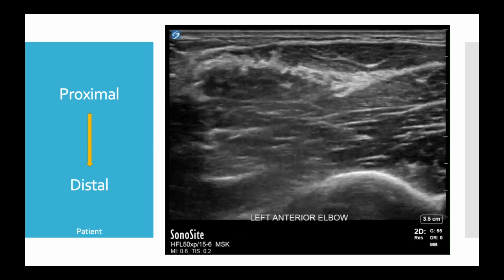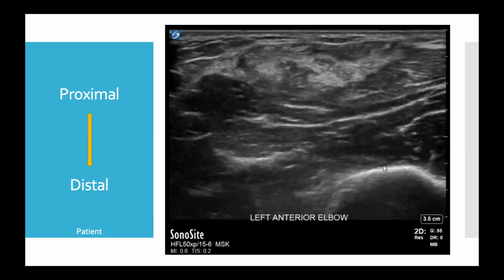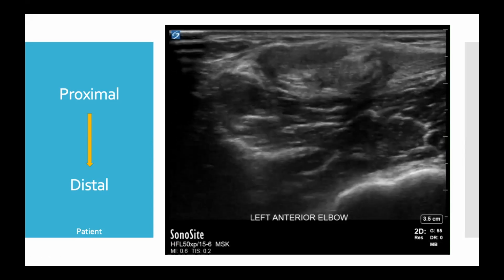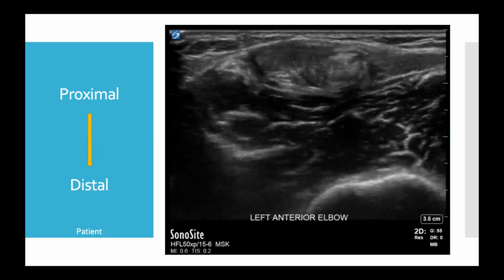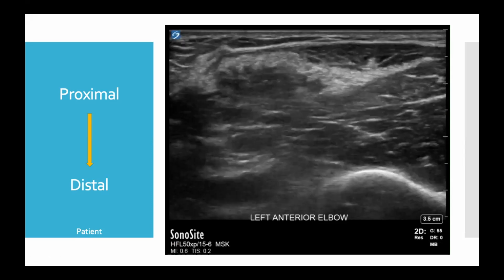So now this brings us to our patient. What I just showed was a normal anterior elbow. What I'd like to share now is a couple of clips of the patient's examination in short axis. If you focus on that same area of the screen as the clip progresses, we can clearly see that it does not look the same, just to be blunt.